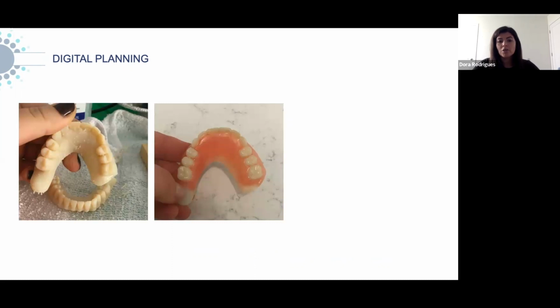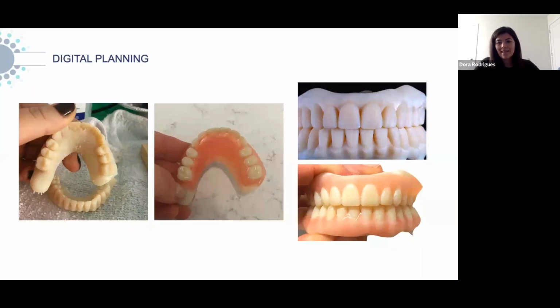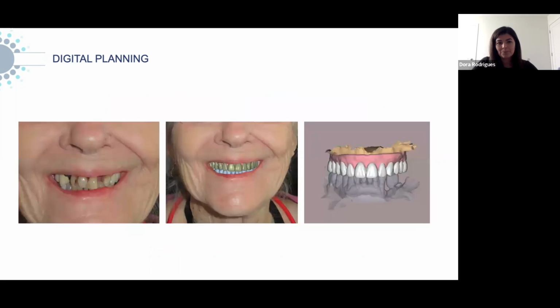So this was my very first printed denture, and this was probably 4 years ago. I was scared to death that this was going to break and it was not going to work out because I was not used to doing this type of case. The last photos are from the iPhone, so it wasn't that pale, but it turned out pretty well. I was very happy with how everything turned out. The midline is off, yes, but based on everything that I went through, we started designing this case, and all the information that I didn't know. I was pretty happy for a temporary like that.